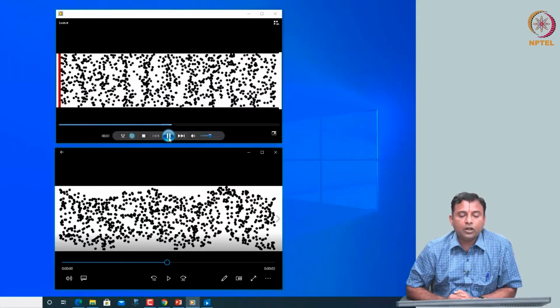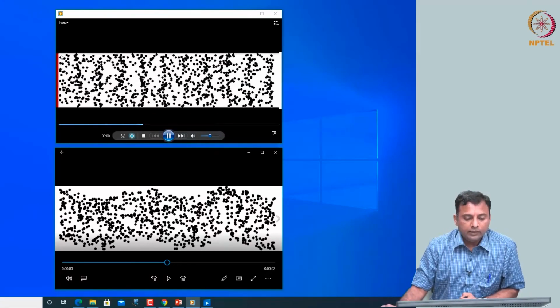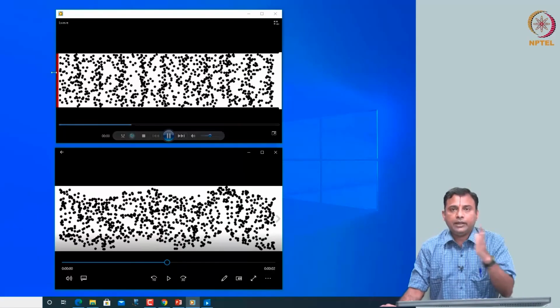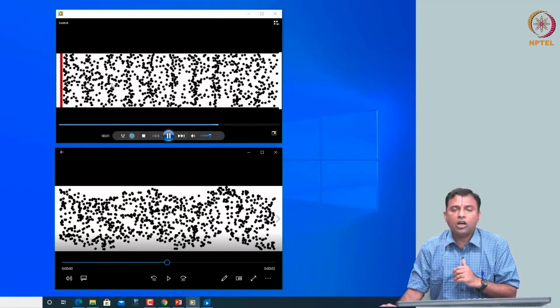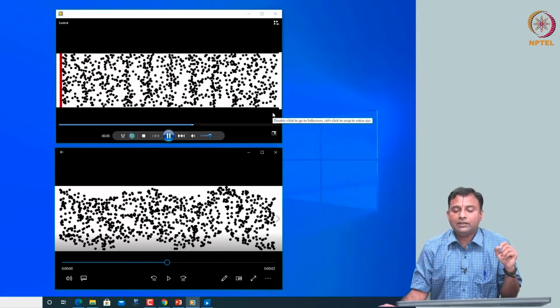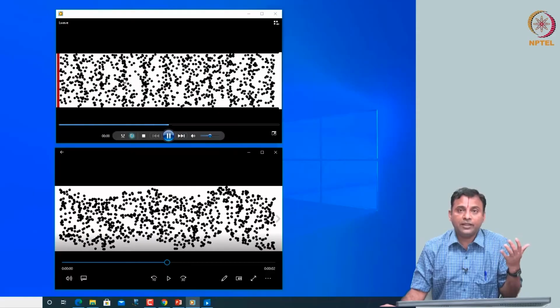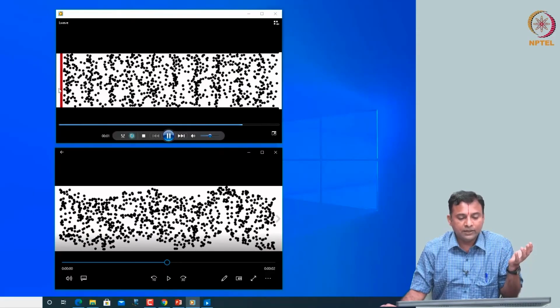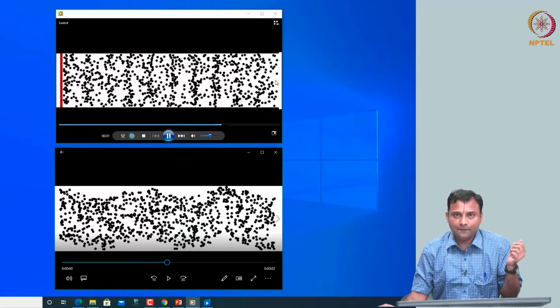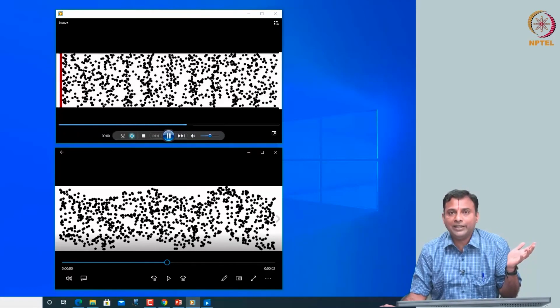So, what do you see in the top, right? Well, this is essentially kind of a piston. This is a medium, and these are all representations of particles in the medium. For an untrained eye, what do you see? If you are thinking like most people, you look at it and see there is something going from left to right. There is motion from left to right. That is your wave. So, you can clearly see that the wave is traveling from left to right.